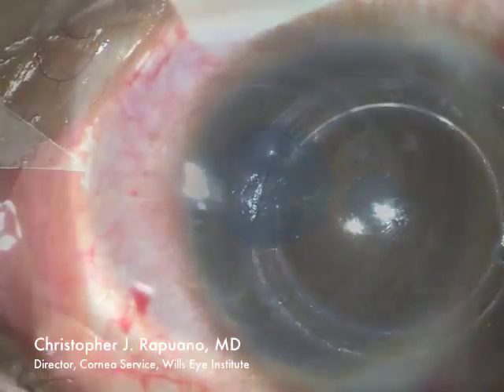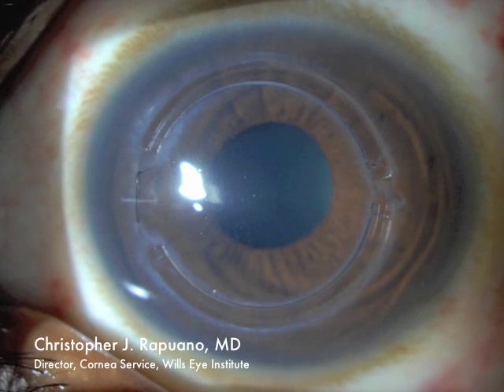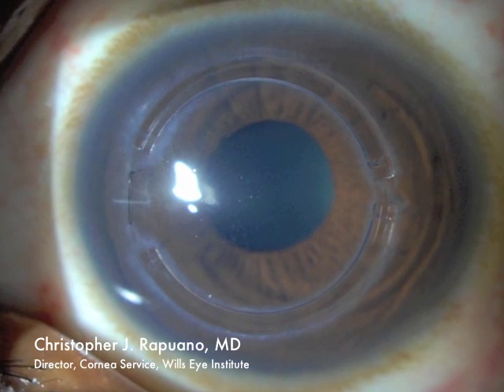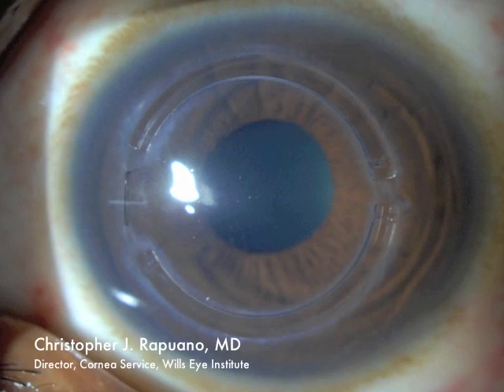At the end of surgery, the intacs look beautiful. Here is a post-operative day one photograph — nicely centered, well-placed intacs.